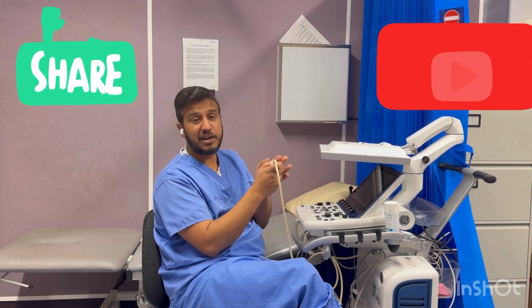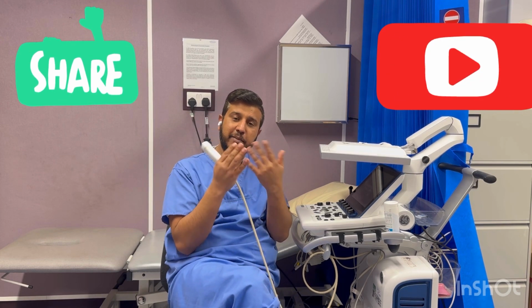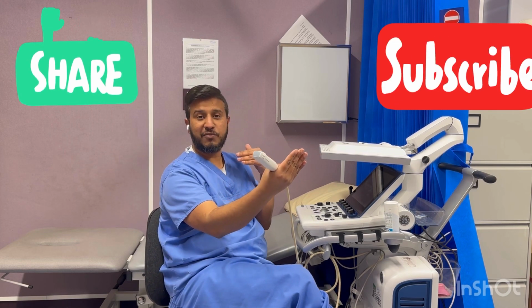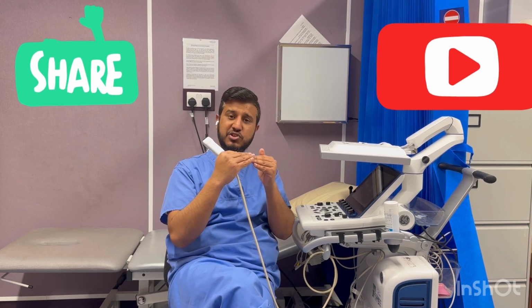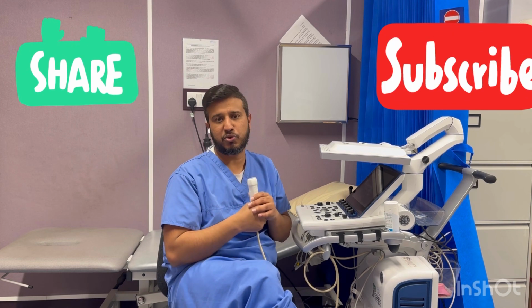Then you will take the probe slightly up and you will see the aortic valve level. In the books, you will just see the aortic valve level, with the aortic valve in the middle, okay? And then the pulmonary valve on the right side, and on the left side, the tricuspid valve. But actually, the pulmonary valve is situated slightly above the aortic valve, or it is slightly superior to the aortic valve.